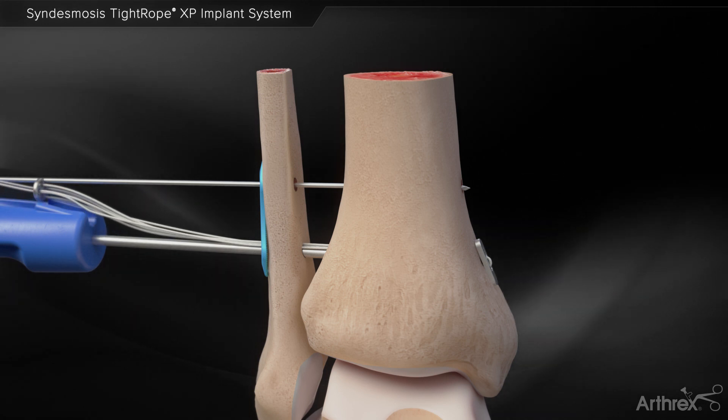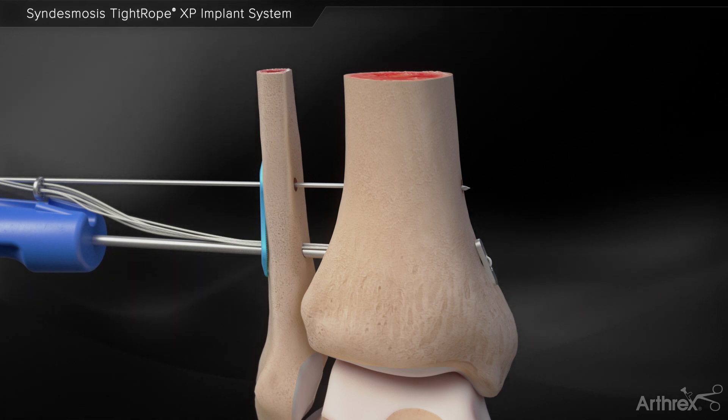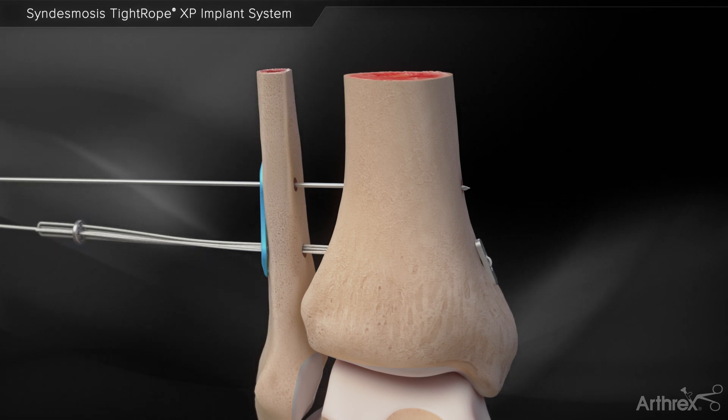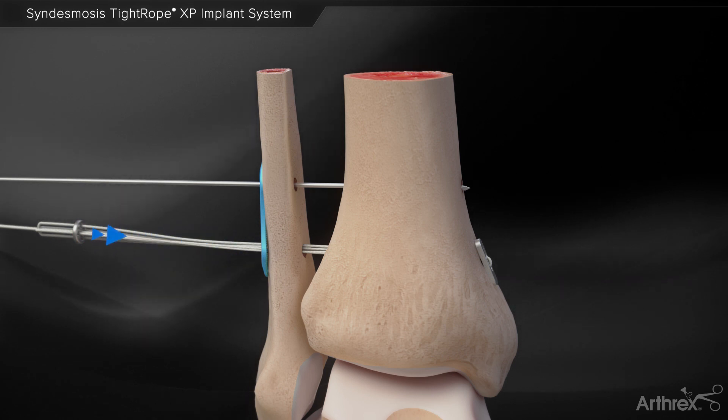Unwrap the trailing sutures from the tightrope XP driver to release the round button. Remove the tightrope XP inserter from the bone tunnel. Grasp the center sutures of the round button before tensioning, then slide the round button down to the plate.